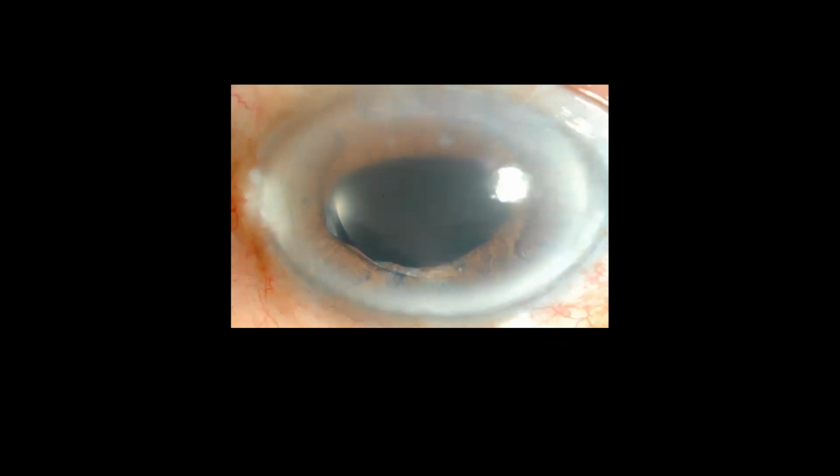So this lady came to you while you were on call 3 weeks ago, and she came to you again while you are on call having the same problem, pain and headache and pressure of 60. What's the problem here? Okay, there is a dislocated IOL. It's intended to be anterior to the iris. So what kind of IOL is this one? Okay, it's an AC IOL.